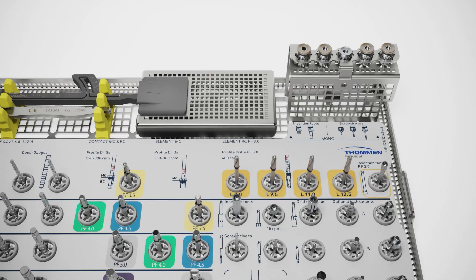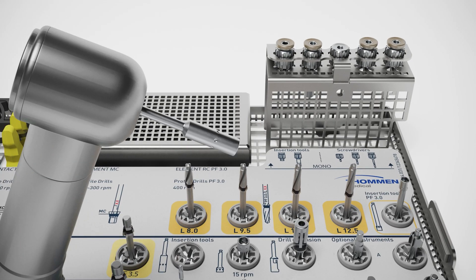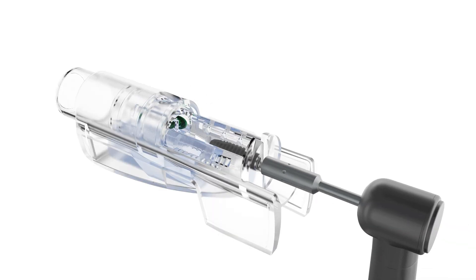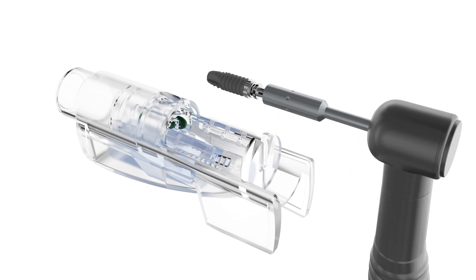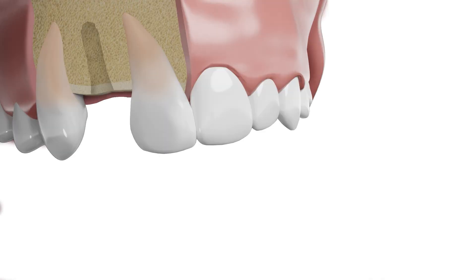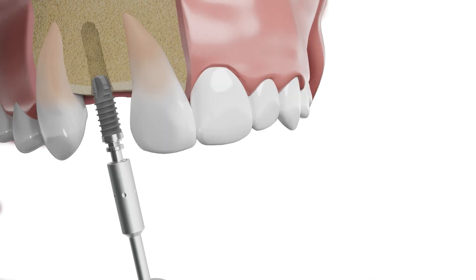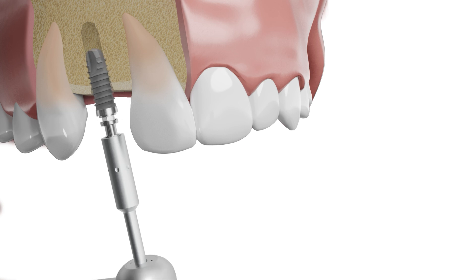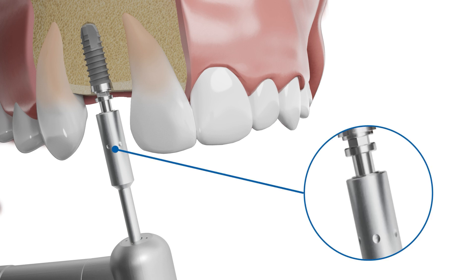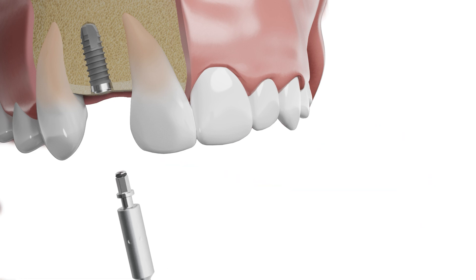For mechanical implant insertion, use a handpiece adapter with a maximum rotation speed of 15 RPM. Press the lateral wings on the applicator together so that a gap in the implant holder opens. Carefully remove the implant from the implant holder. To ensure adequate access to the screw channel of angled abutments, it is mandatory to strictly align the implant to one of the position dots in a labial direction. Once the implant has been placed, take out the insertion aid in an axial direction. If there is a high insertion torque, a short counter movement will facilitate the removal.